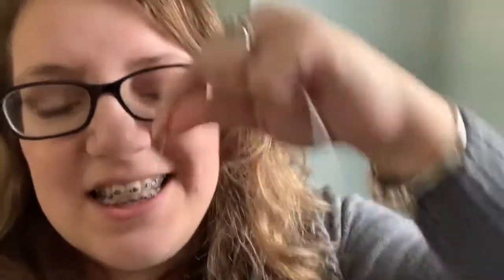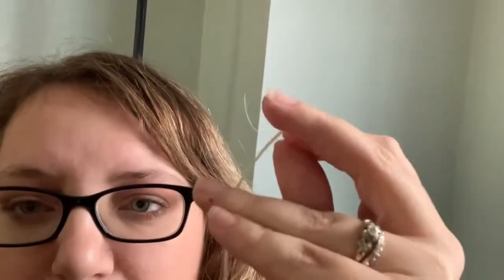Usually when you're flossing, you go from up and put it through like that, and then when you're going this way, you come from the bottom. It just makes it so much easier to get it in. Super Floss then has a thicker part here, which is really great for in between your appliances, these little pieces here, to get cleaning.